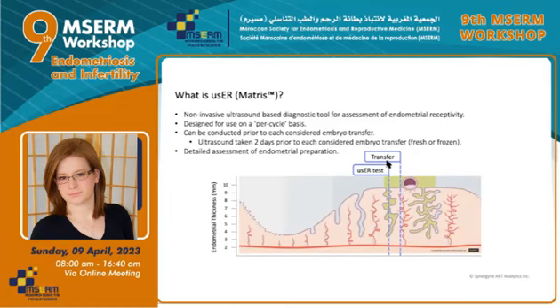There's a multi-tiered computational workflow and scoring algorithm that the images pass through, and then a receptivity score is assigned. Those scores are then reported back to the clinic within about 24 to 36 hours. And the timing interval between the testing and the anticipated transfer is important because if the endometrium is identified as a deficient or suboptimal environment and a deferral of the transfer is recommended, it allows enough time to ensure that the lab can accommodate those embryos and make sure that they go into storage for use in a later cycle.